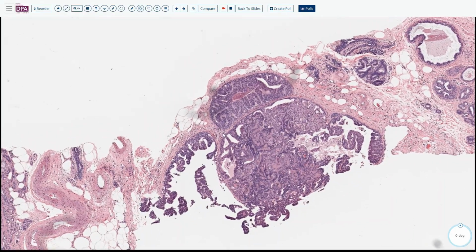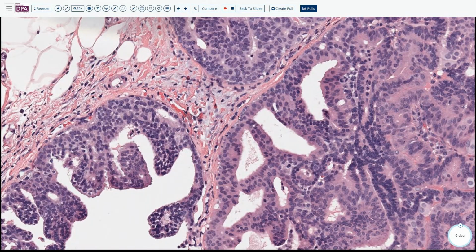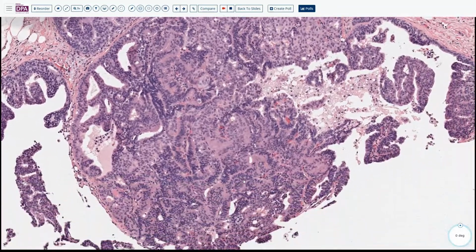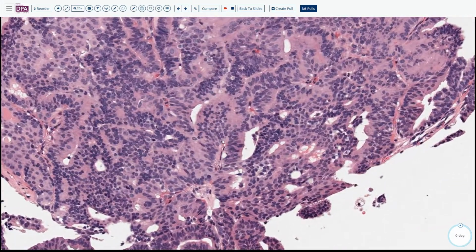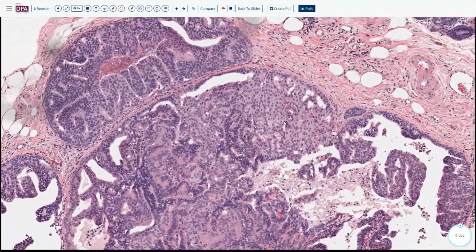Before we zoom in, we always want to check the outside. Here we can see the myoepithelial cell with clear cytoplasm, and we can make a distinction between this myoepithelial cell and this luminal cell. And here it looks more like a benign intraductal papilloma with some UDH changes, because we still can see some myoepithelial cells around the papillary structure. But in this area, something is different.